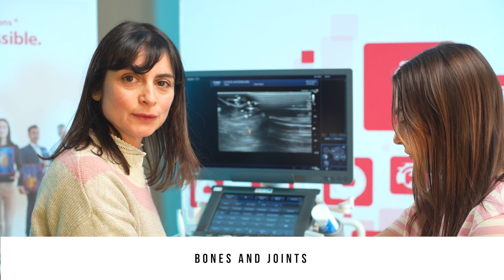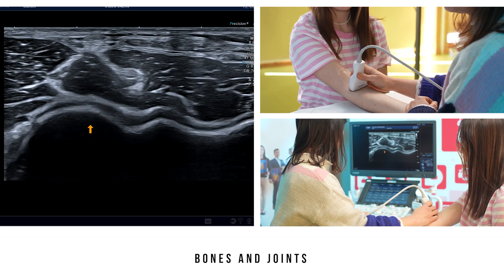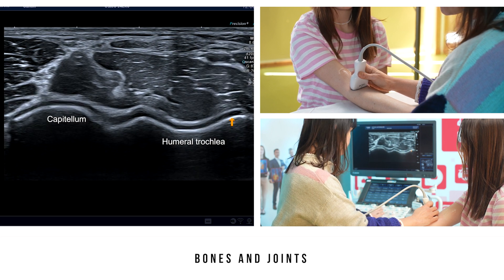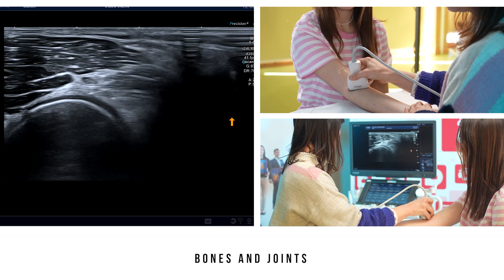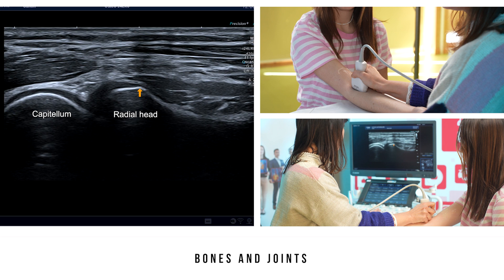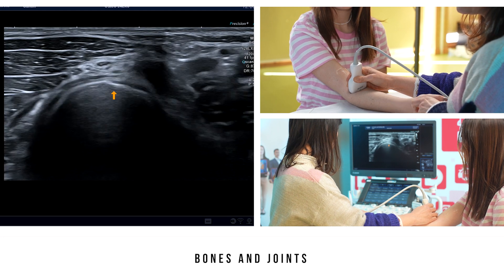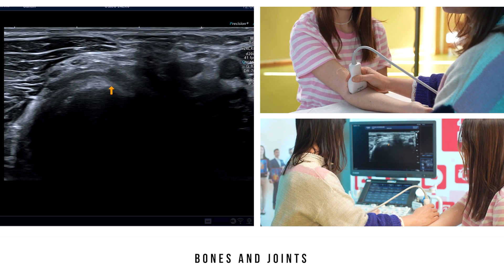We will start with the humeral radial and humeral ulnar joints. Place the probe in the transverse plane at the level of the humeral trochlea. Laterally, you can see the convex shape of the capitellum and medially the margins of the humeral trochlea. Still on the lateral side, place the probe in the sagittal plane to view the capitellum superficially and the radial head distally with its rectangular surface. In the axial plane, we observe the movements of the radial head, located under the annular ligament.